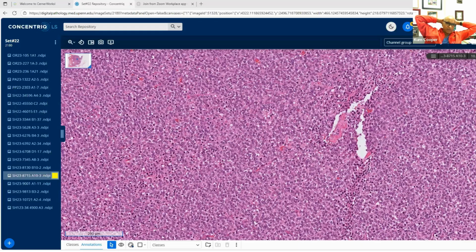And those are also polyphenotypic, epithelial and mesenchymal. And WT1 is useful there as well, because that's EWSR1 and WT1. So there you go, there's another lesson for promiscuous EWSR1. But in that context, if you have good immuno and good morphology and good setting, you can make that diagnosis. And if you have FISH, it's nice to get the FISH to confirm that. We've seen a couple over the last few years of it.